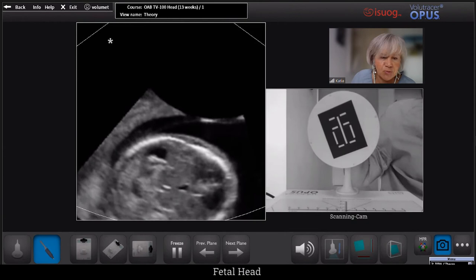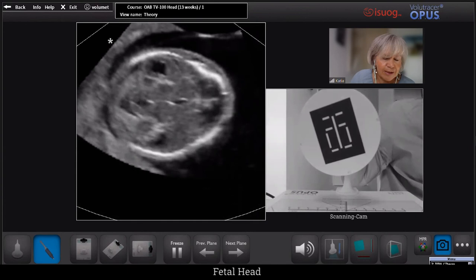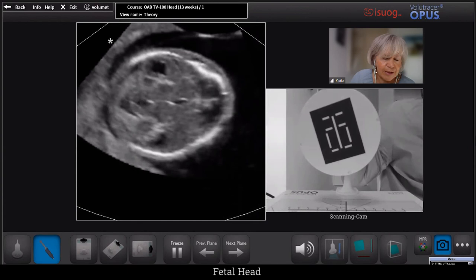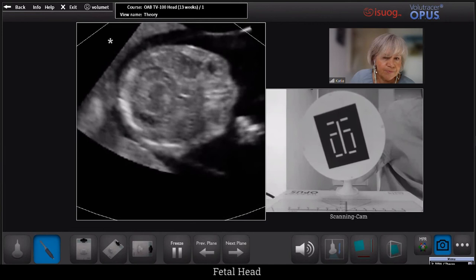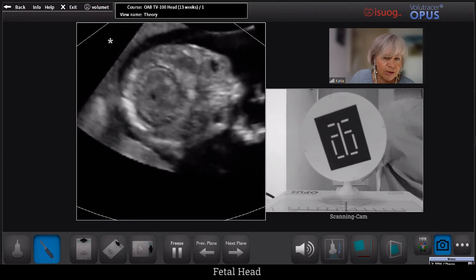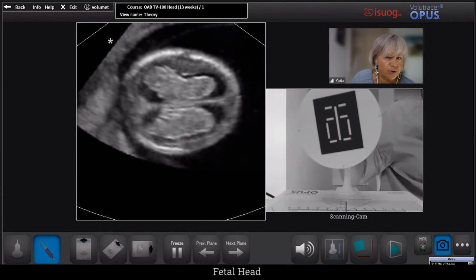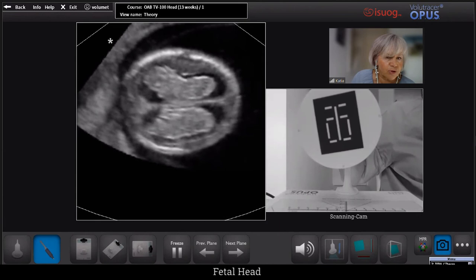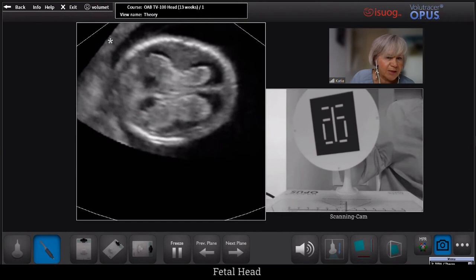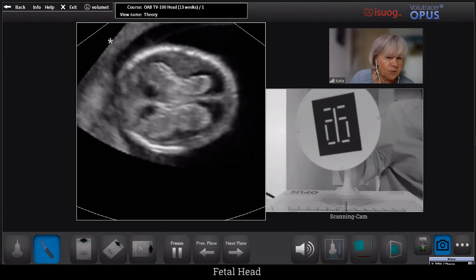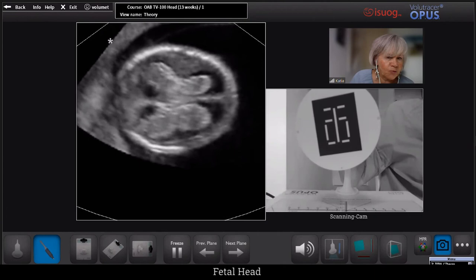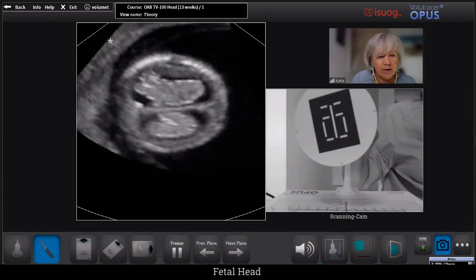Let's now inspect this volume. This is a volume of the fetal head — these are cross-sectional views. We can see very nicely the orbits, the nose, and the hands close to the mouth. Let's try to get the picture we would use to measure the head circumference or the biparietal diameter. This is a pretty nice picture where we see both the choroid plexa and also the falx, so you may want to use this picture to measure the head circumference.